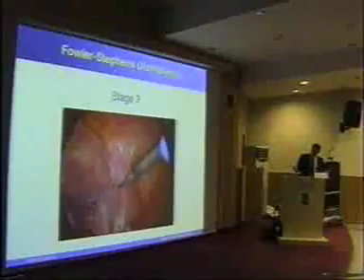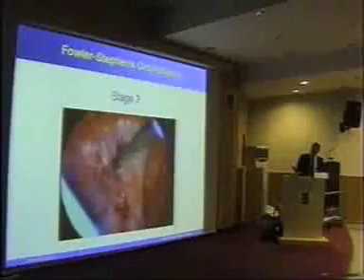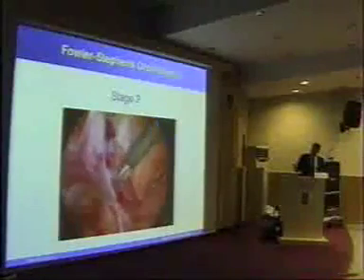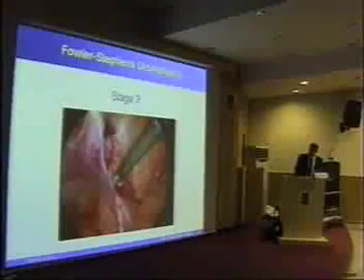And this is strip of peritoneum. We're just mobilizing. There's little blood vessels in it, and this is going to give us a nice length of tissue. We're holding the testicle up. You can see the vas here, the vessels running alongside it, just dividing these little peritoneal attachments. The next slide's a bit quick, so you've got to catch it.